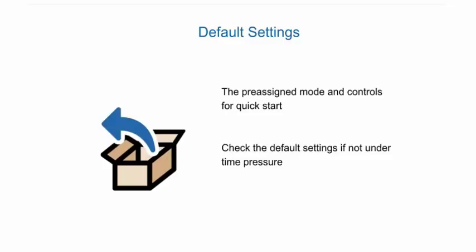A modern ventilator usually has a default mode and its default control settings. The defaults are designed for quick start of mechanical ventilation. Yet, if not in a hurry, you should set the mode and controls individually for each patient.